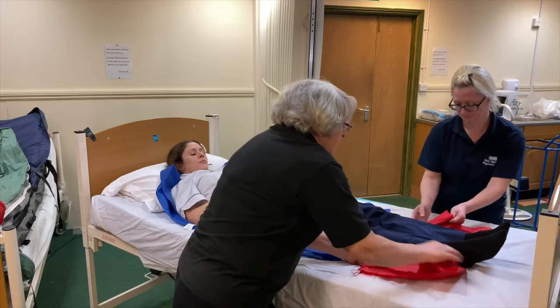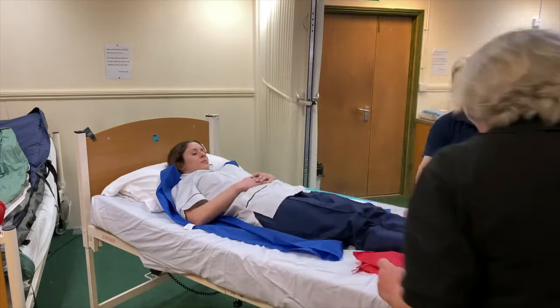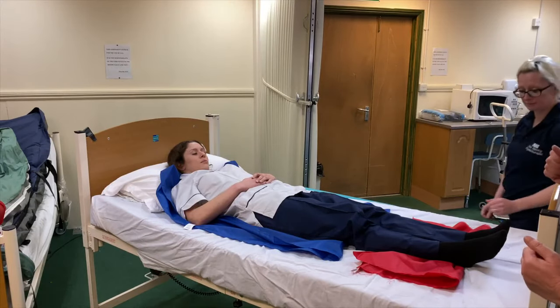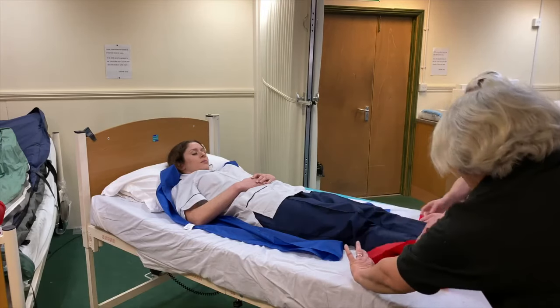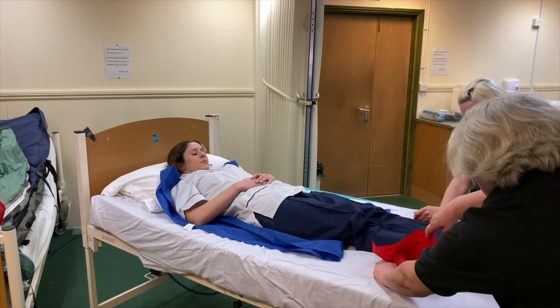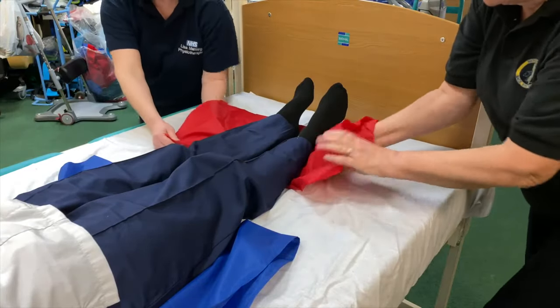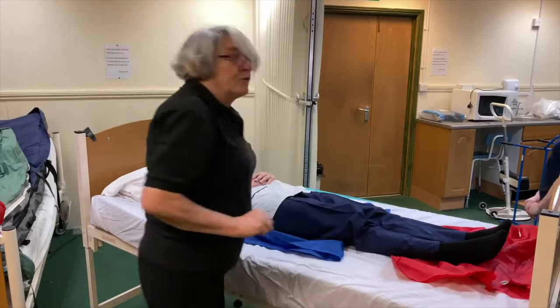Okay, and we're still using the idea of using the slide sheet. And if I just come to the end of the bed, you don't need to get this far down. Lisa can stay in her position. But as you can see, you then take hold of the under part of the slide sheet, and using your weight transfer, you then put it under the heels, and you haven't had to move the vulnerable legs.